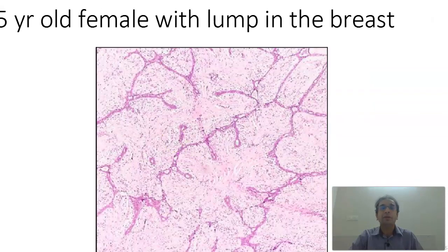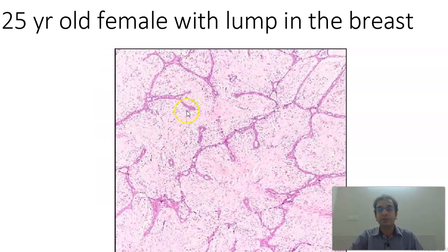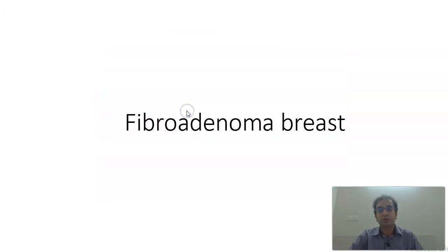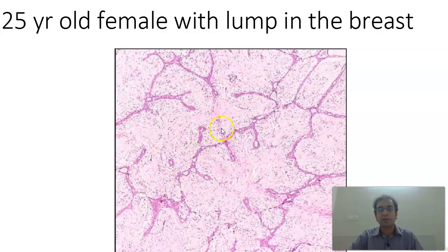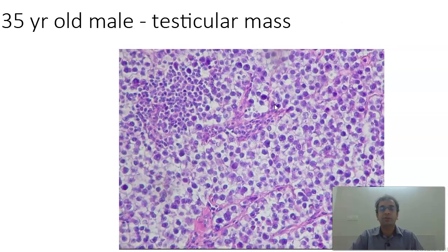A 25-year-old female with a lump in the breast. What you find here is an intracanadicular pattern of the ducts, which are compressed by the proliferation of the stroma. This is going to be a fibroadenoma of the breast.